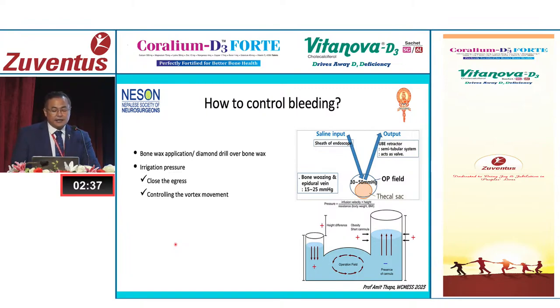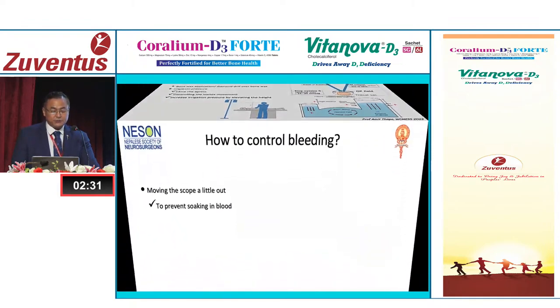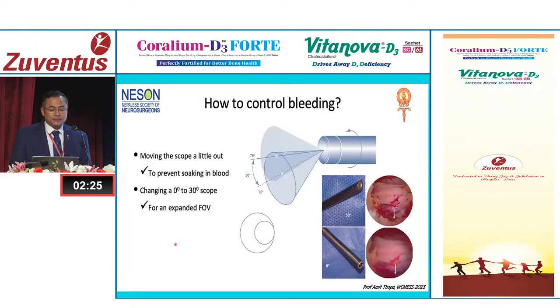And then, of course, you can control the vortex movement by this, and you can also increase the irrigation pressure. Then we can use the scope. The scope has to move out a little bit so that it does not get soaked up in the blood. We can use a 30-degree scope in these phases, because with its eccentric view and rotating movement, you can have an extended field of view on the operator side.